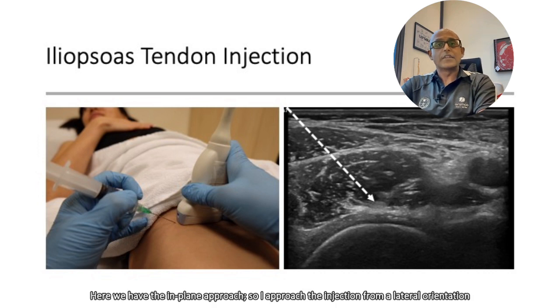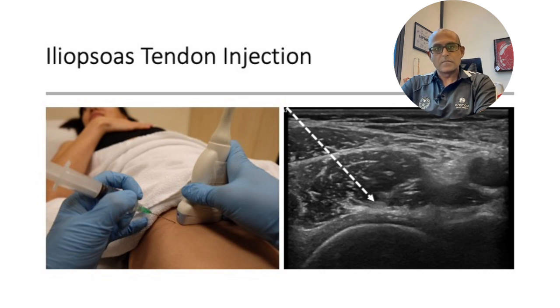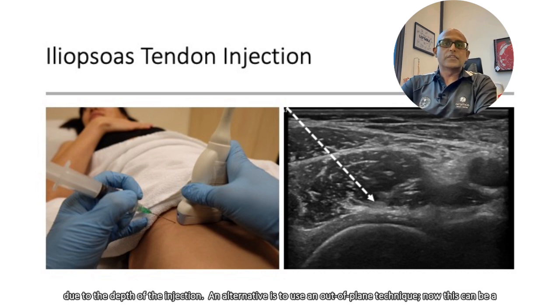Here we have the in-plane approach. So I approach the injection from a lateral orientation using an in-plane technique, and I'm aiming the needle approximately 45 to 50 degrees, depending on the habitus of the patient. Remember, you may need a slightly longer needle due to the depth of the injection.